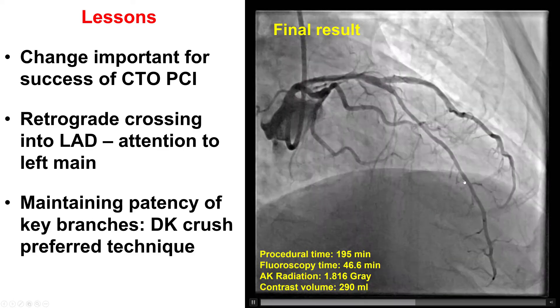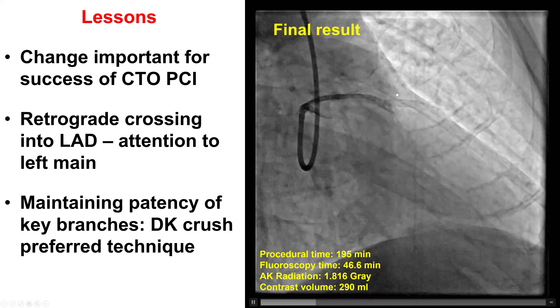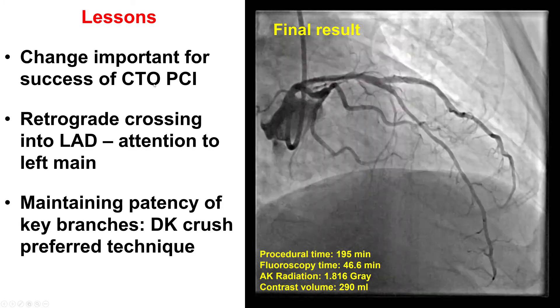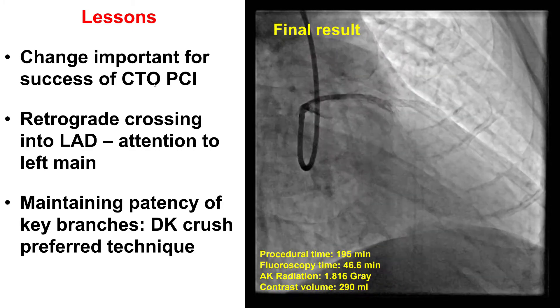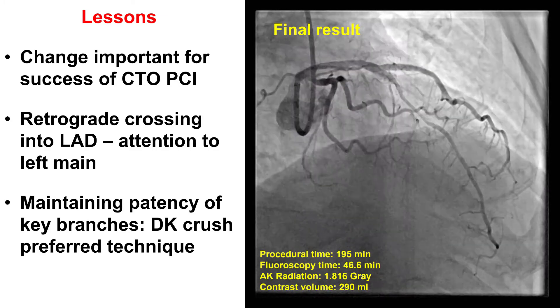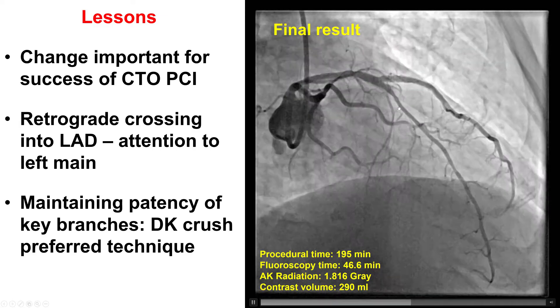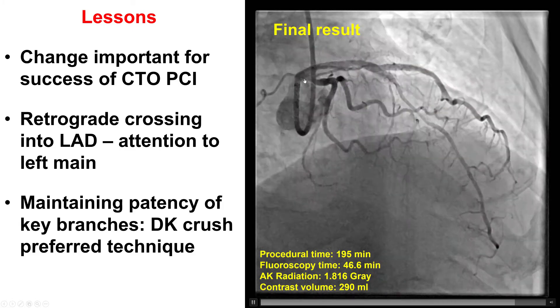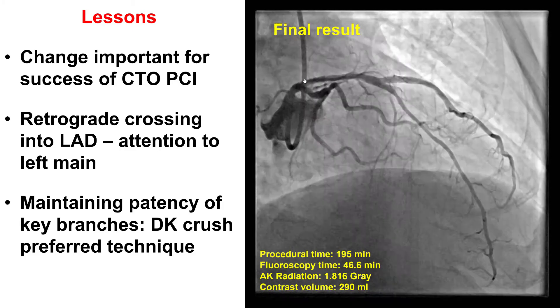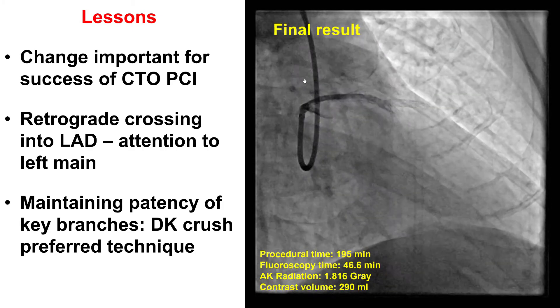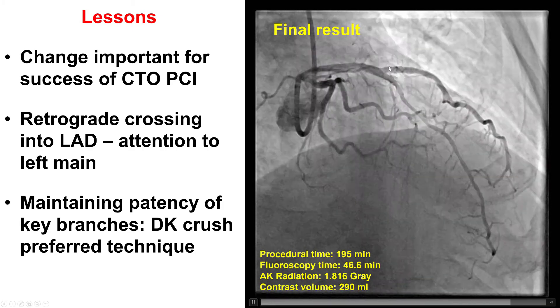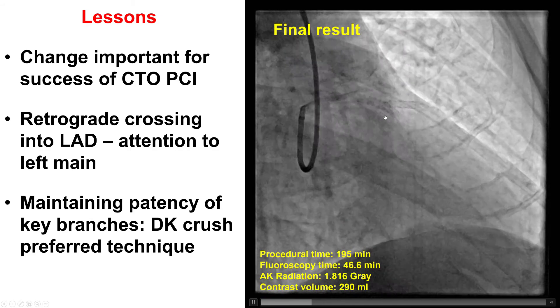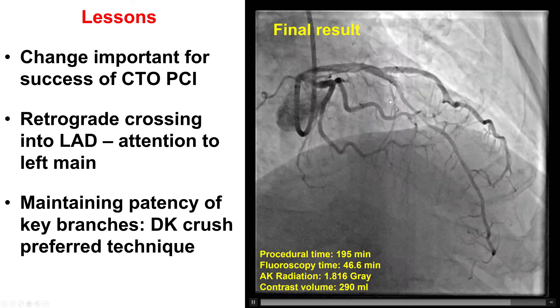We can see that the LAD caliber has already increased after restoring antegrade flow. Several lessons from this case: first, the importance of flexibility — antegrade wire escalation did not work, but a retrograde option was available and used successfully. Second, when there is retrograde crossing into an LAD CTO, it is important to prevent injury of the left main, which is why using a guide liner and intravascular ultrasound guidance are helpful. Finally, maintaining patency of key side branches can be done with an upfront two-stent technique, and the DK crush technique may provide the best outcomes in this setting.